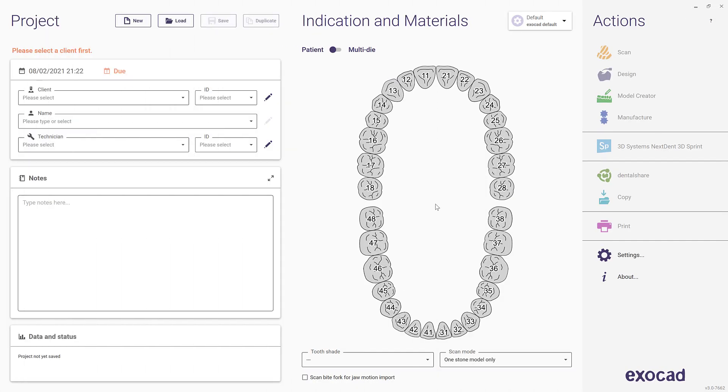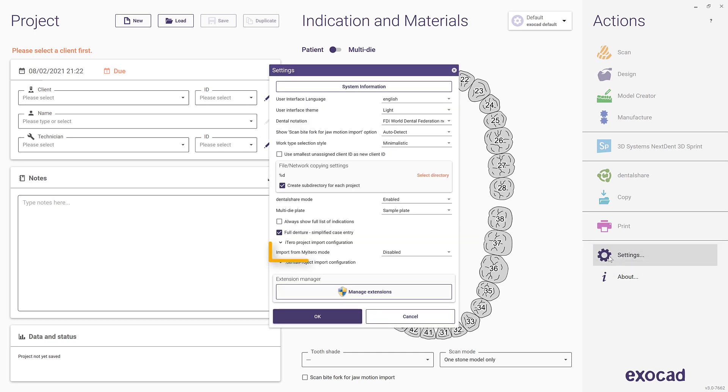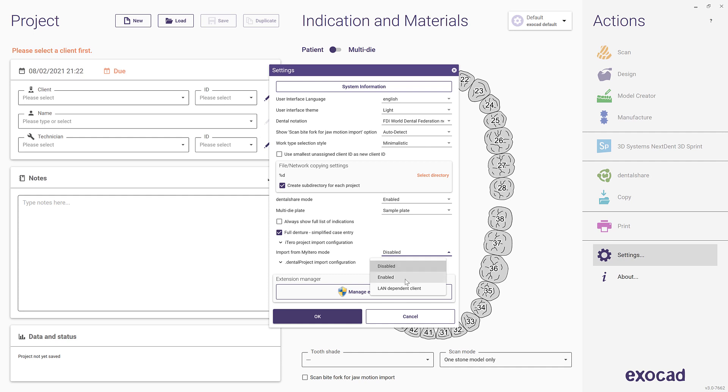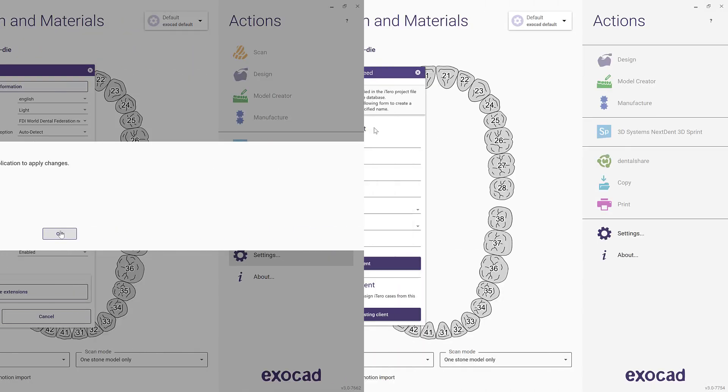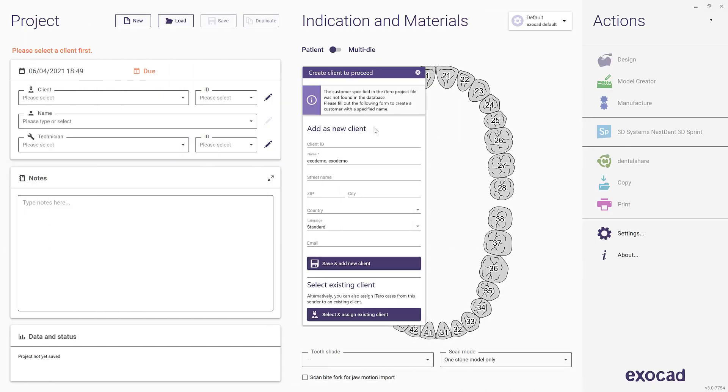If you have skipped or disabled My iTero connection, the DentalDB will start without showing the My iTero connection screen. You can simply re-enable My iTero connector by clicking on Settings in DentalDB and setting My iTero import to Enabled. On next start of the software, you will see the My iTero login window where you can enter your credentials and login.